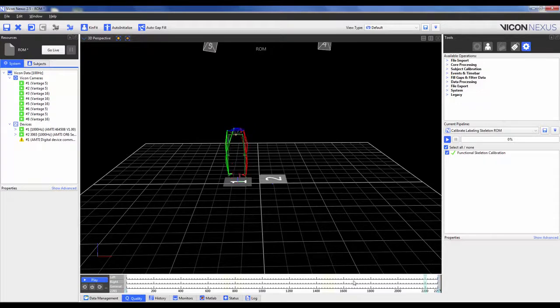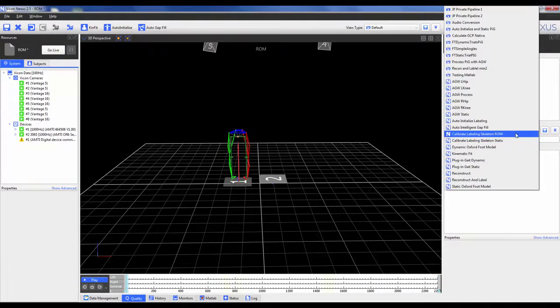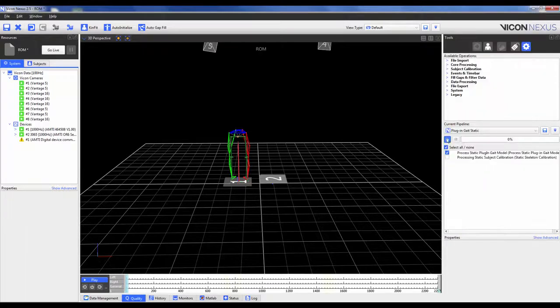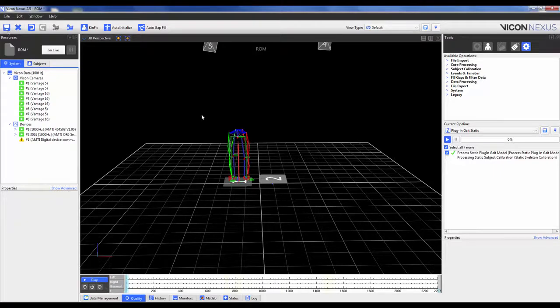Once it's complete, we can scrub back to the first frame where they're in the static position and we can go in and run our plug-in-gait static, just like we normally would. Now we can go in and save the trial and then process our dynamic trials like normal.